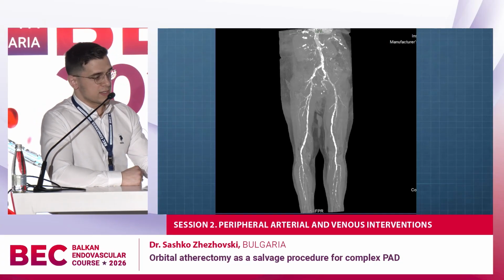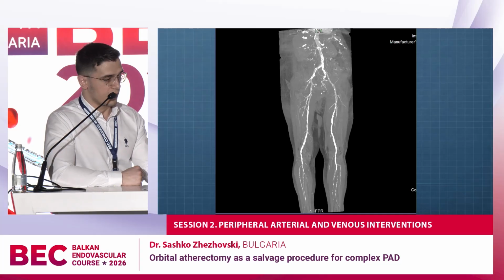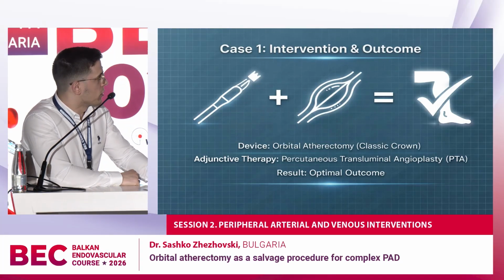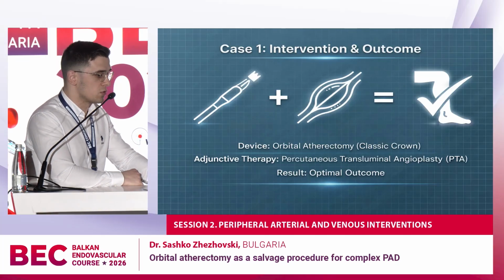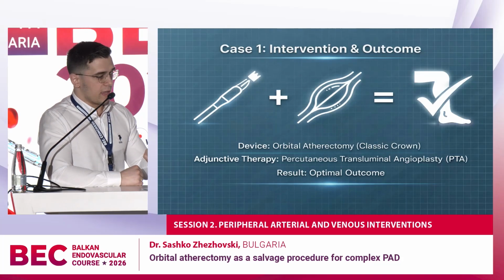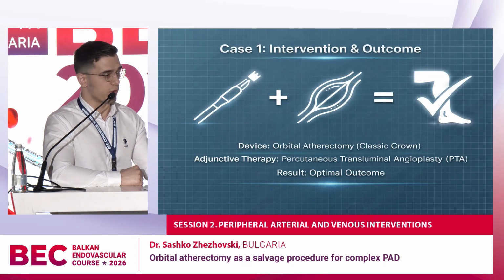So this is the vertical CT of the patient. You can notice the severe calcification. So we took a decision, entirely clinically based, to talk it through with the patient, because in this case this procedure is not reimbursable, and the patient has to pay for everything.